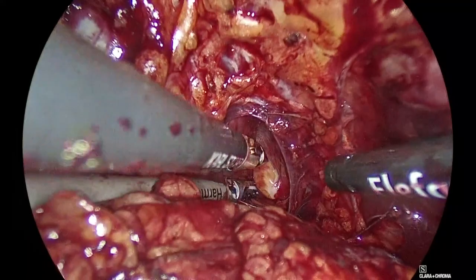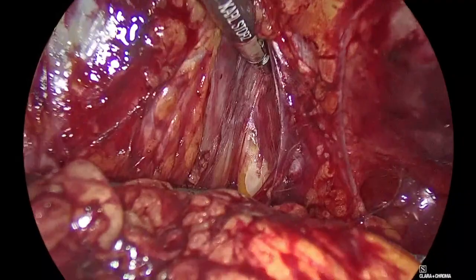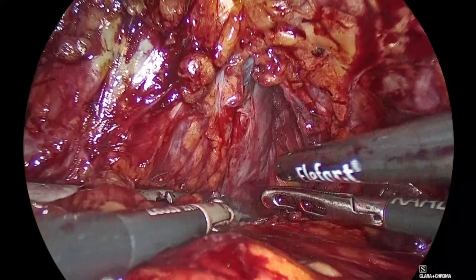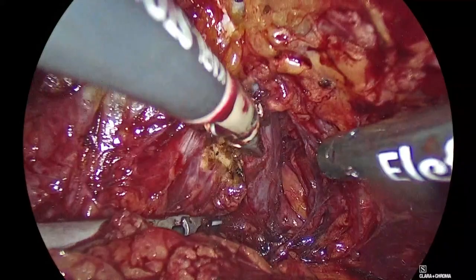Right side. And a lot of blunt dissection here also. There you go. As you can imagine, everything is more or less stuck here. Good. Hemostasis is very important for me in this kind of surgery. I want to be working on a dry field. My assistant is Panayotis Kalidonis, and the camera is held by another colleague from Greece, so it's a Greek team today playing here.